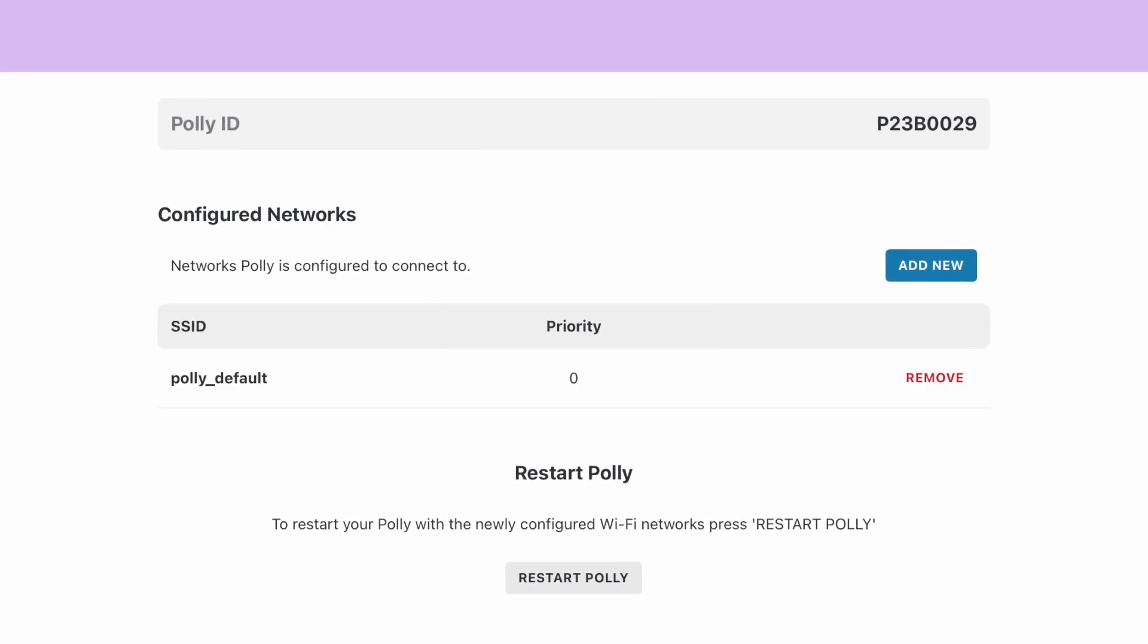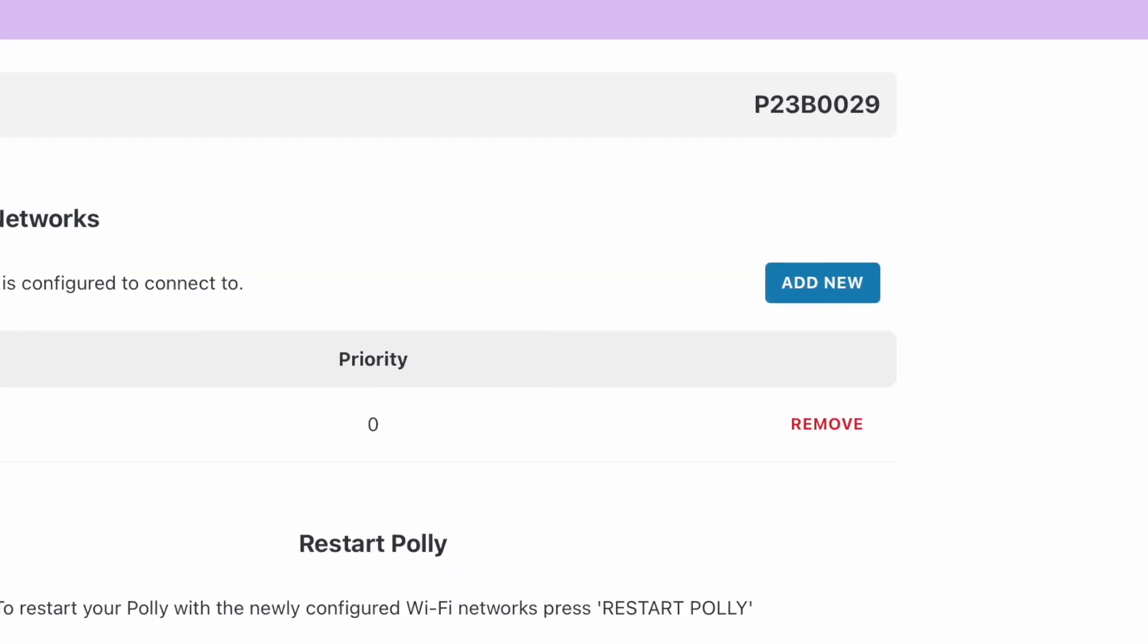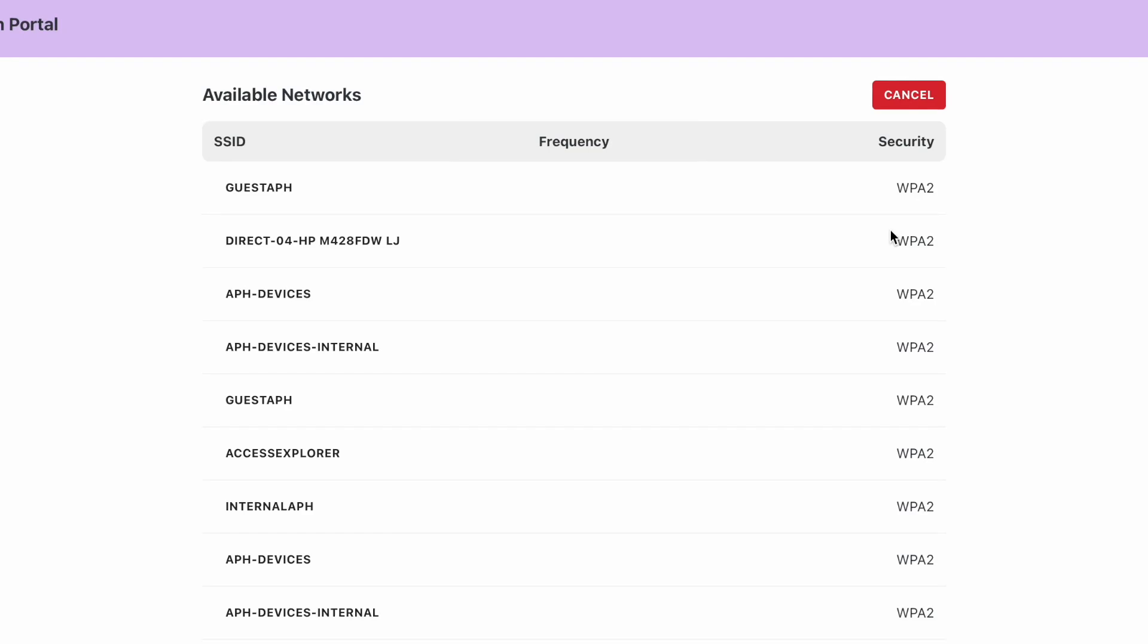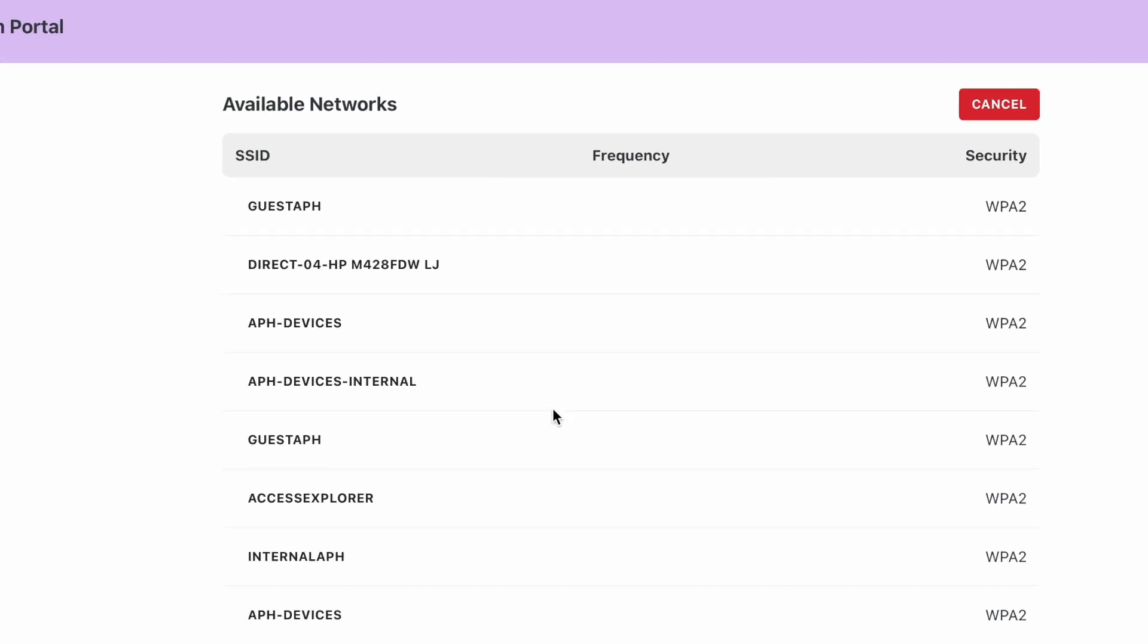Next, select the Add New button. The interface will navigate to a new screen showing the networks available to Poly. Select yours.